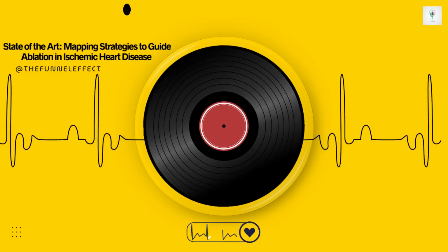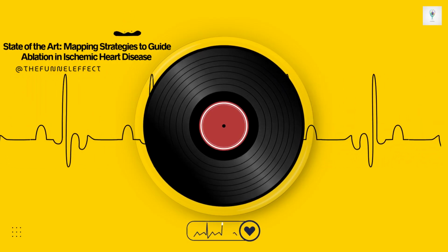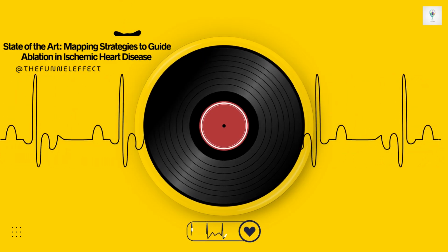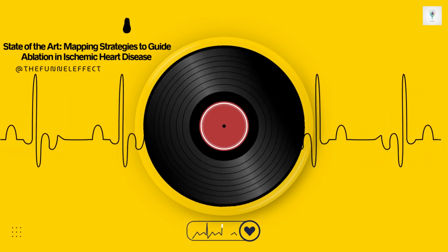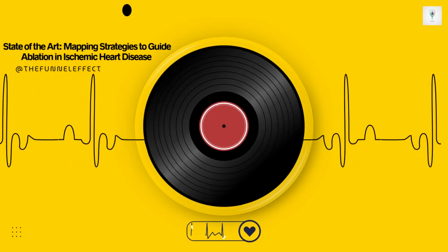And third, sometimes the suspected origin of the VT is in a really high-risk location, maybe very close to the heart's normal conduction system, the His bundle, or near a major coronary artery. In those cases, you need absolute certainty about the target before you ablate, which often means mapping during VT. The risks seem obvious, particularly keeping the patient stable hemodynamically.